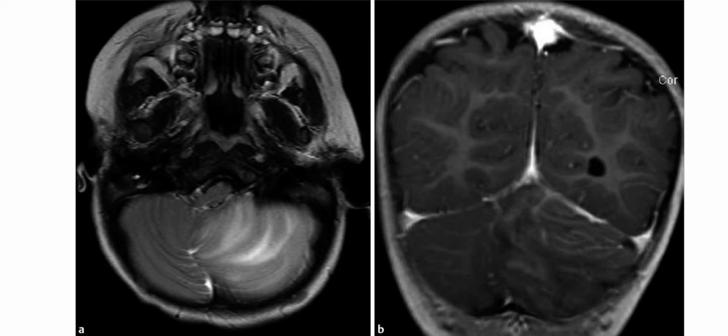So this is a young girl who has presented with chronic ataxia and gastrointestinal lesions as well. On the axial T2 weighted MRI, there is thickening of the left cerebellar cortex with regions of increased signal intensity within the underlying white matter, which is resulting in a striated or corduroy appearance. On the coronal post-contrast scan, we can see a similar striated appearance of the left cerebellar hemisphere, which is secondary to the decreased parenchymal signal intensity and enhancement of the overlying leptomeningeal venous structures.